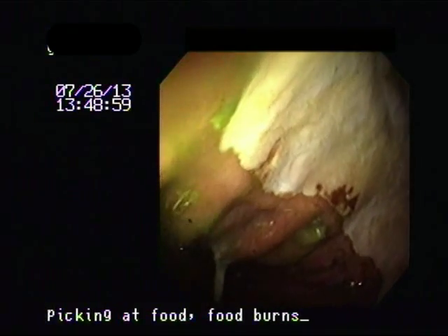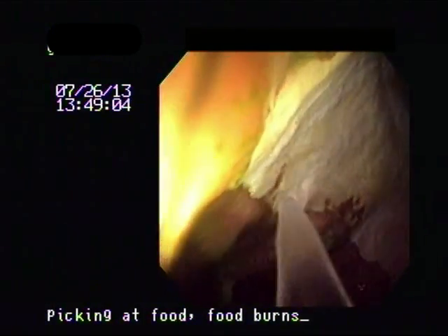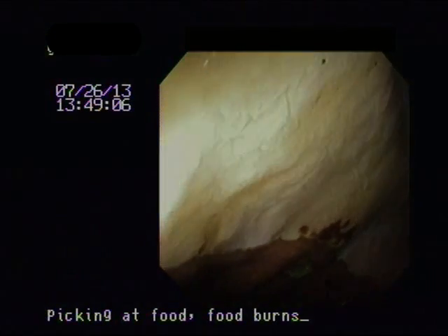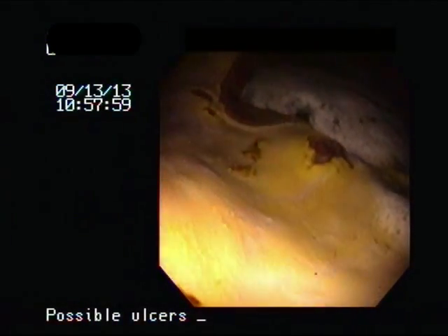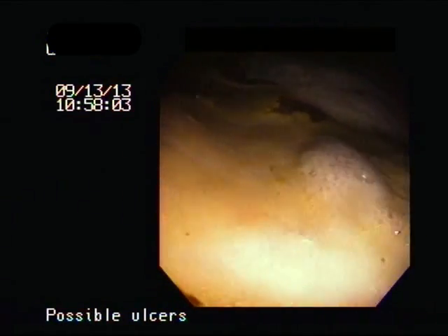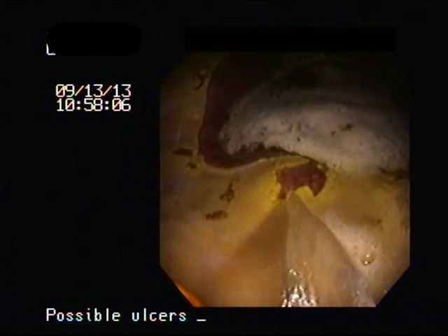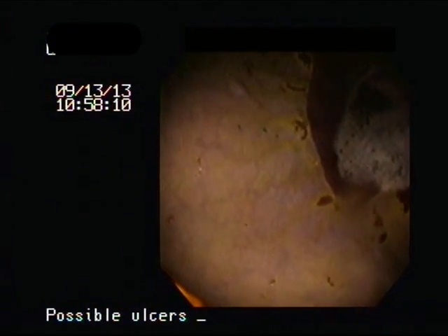Here is a case with deeper ulceration. This is a moderate case with ulcers right on the margo plicatus, and here is a horse with much deeper ulcers. This particular horse had performance issues, being difficult to handle sometimes, and not willing to cooperate.